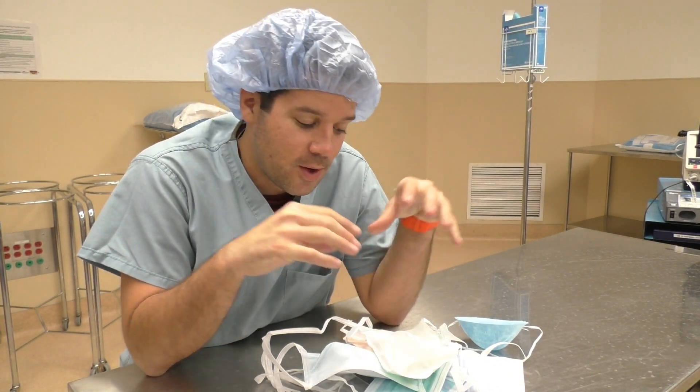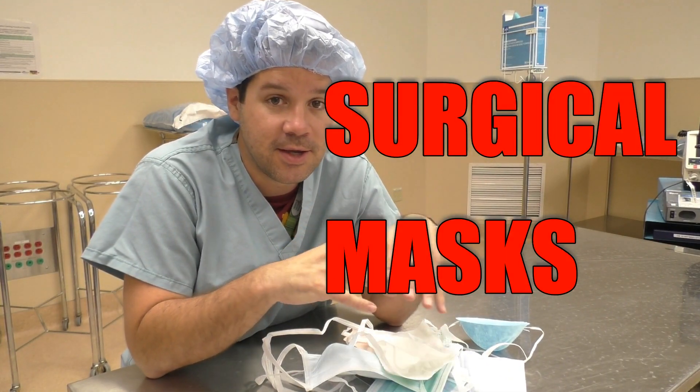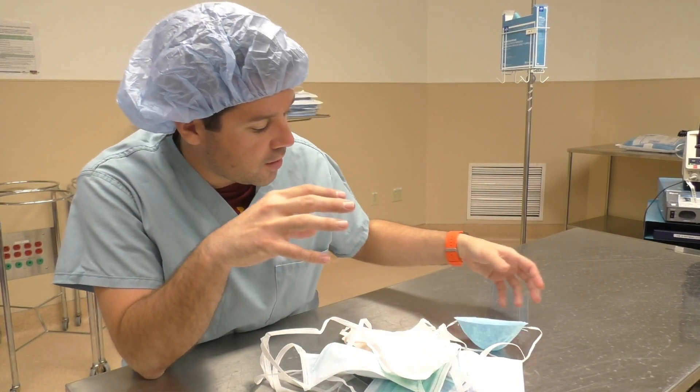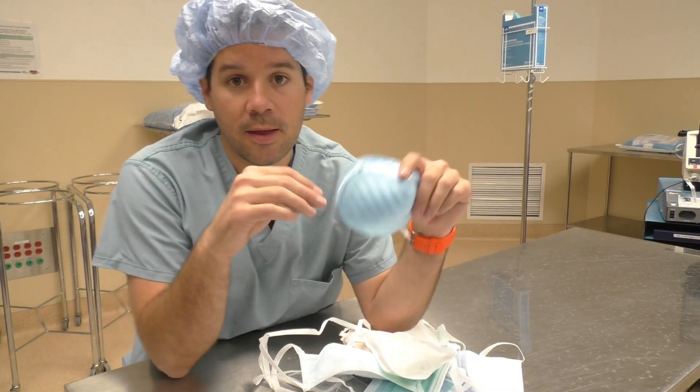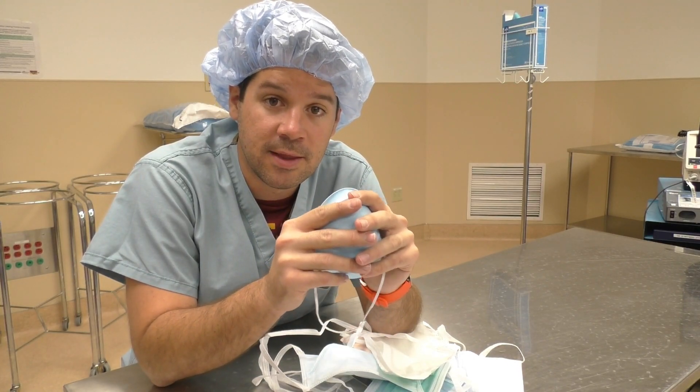Welcome back to another surgical tech tips video. We are talking about masks today, and I want to take you guys through all the masks that we use at our facility, starting with the mask that you should not use if you are scrubbed in in the OR.